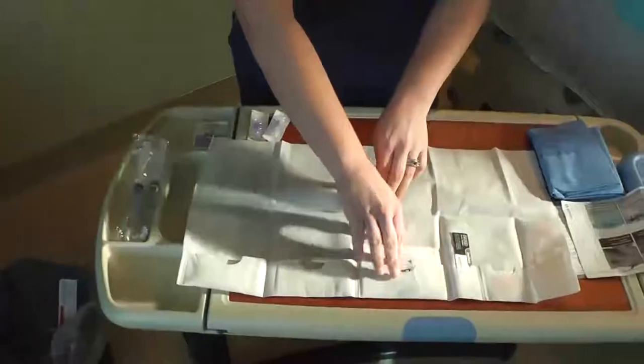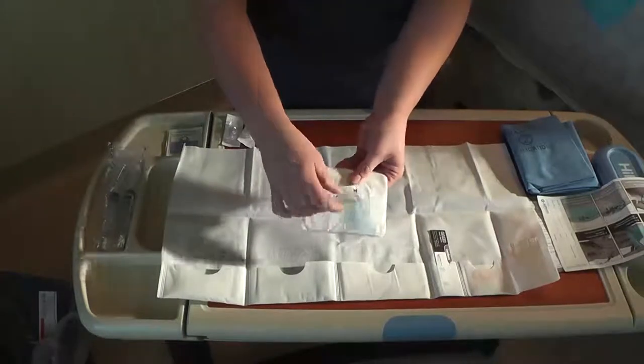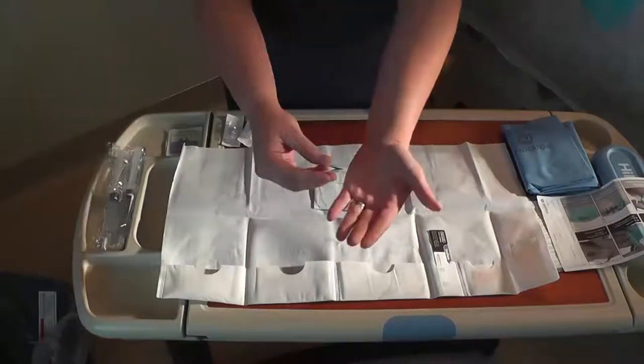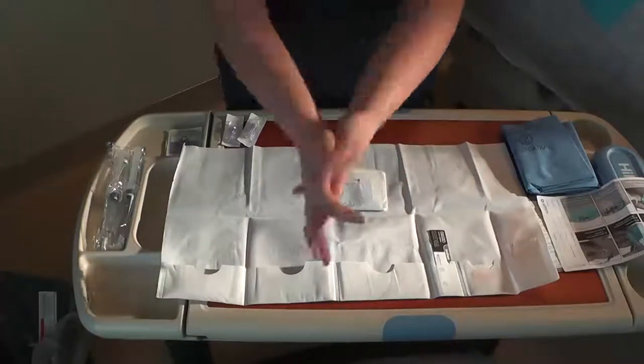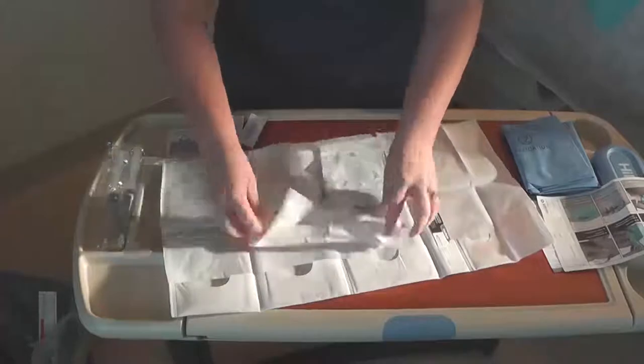Remove the gloves — a Purell hand sanitizer pack is located on the outside. Wash hands, and then don the gloves.